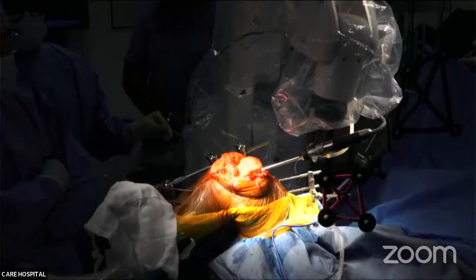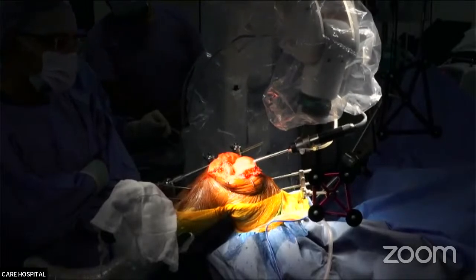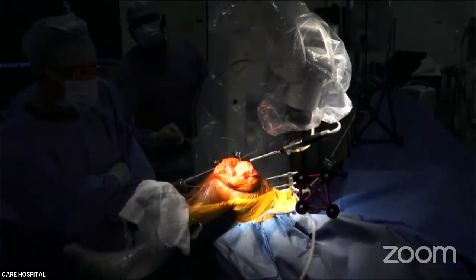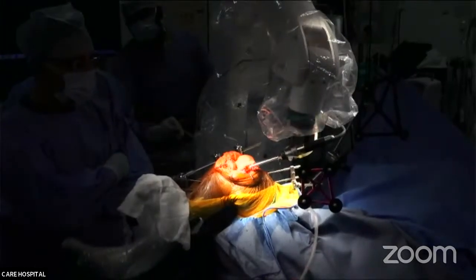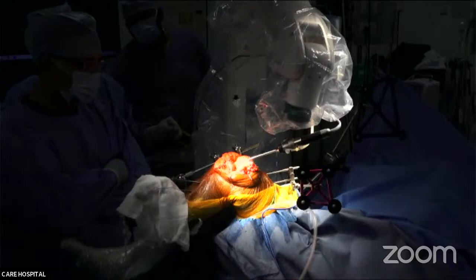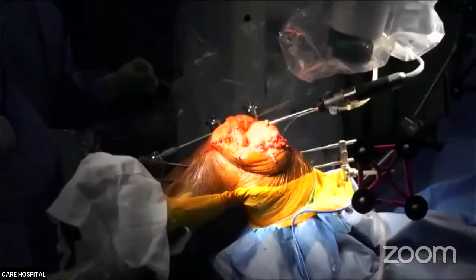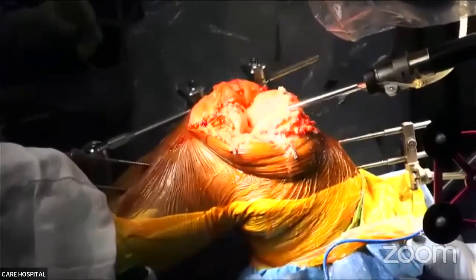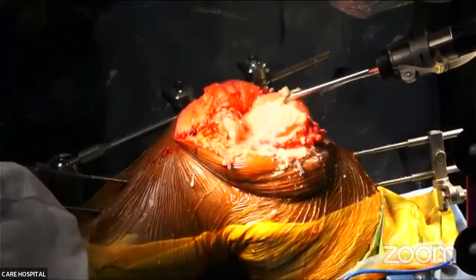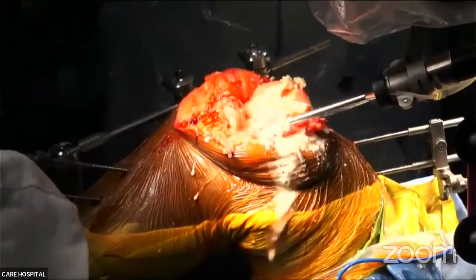So now the robotic arm has started. It's a milling tool and it's a burr based system. While it is taking the cut here, we are seeing it real time on the screen, and it has got a continuous water irrigation system. So the first cut that the robotic arm is taking is the distal femur, and we are doing it through the measured resection technique.